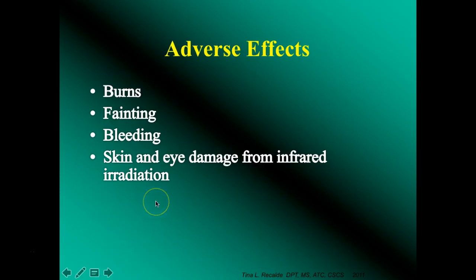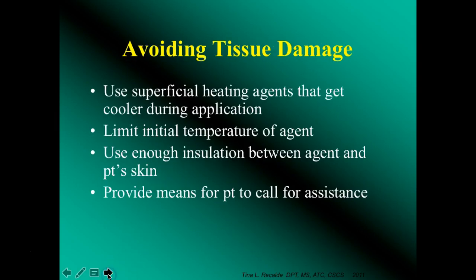So adverse effects. We talked about this, burns being the number one. Fainting, bleeding, skin and eye damage from the infrared irradiation. Avoiding tissue damage: use superficial heating agents that can get cooler during application. So that would be like the hot pack, right? It gets cooler instead of hotter.